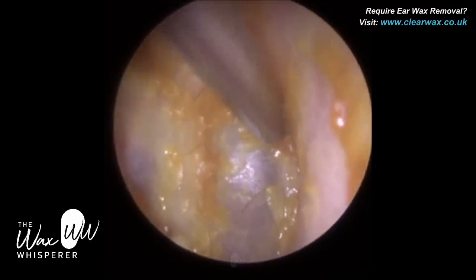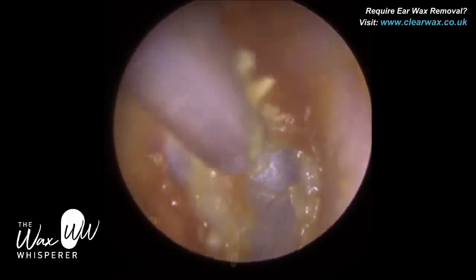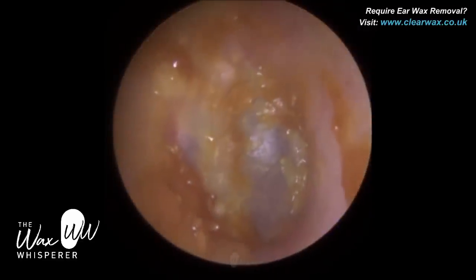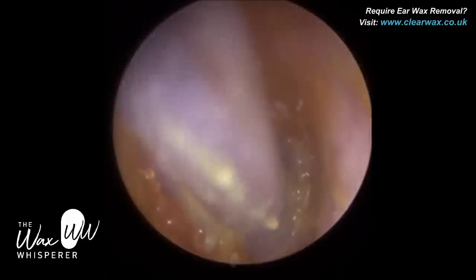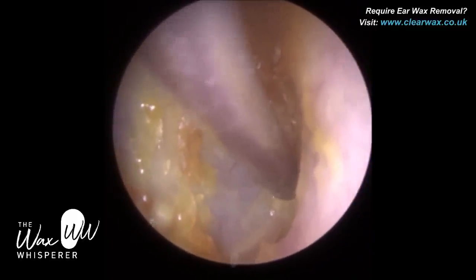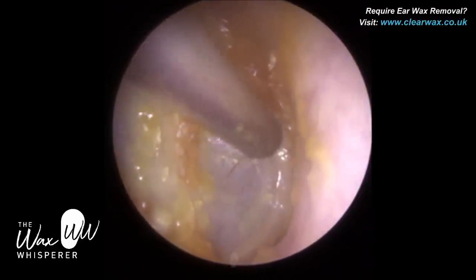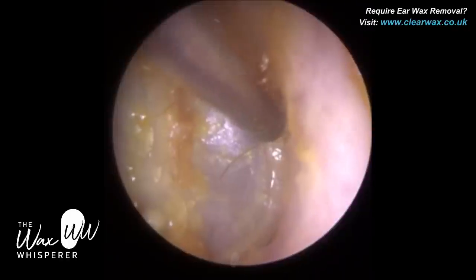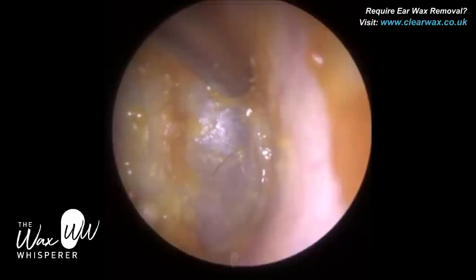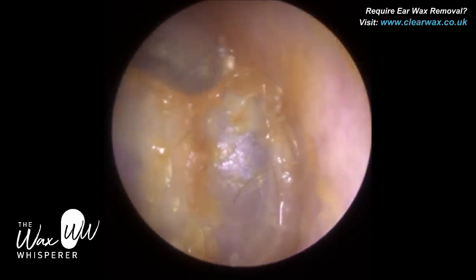We've got some wax in the anterior recess here as well. I've just got to avoid making contact with the ear canal. The inner two-thirds of the ear canal is made up of bone with a very, very thin sheet of skin tightly adhered to it — approximately 0.05 millimetres. That makes the bony part of the ear canal very sensitive. So with the fine-end, I've just bent the tip, which enables access into the anterior recess.